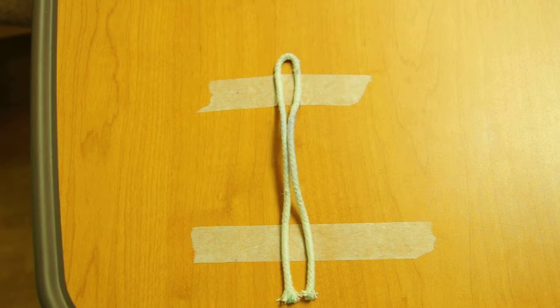It's important to know how to do both left-handed and right-handed one-handed ties, but very rarely have I been in a situation where I had to tie a one-handed tie for the other surgeon.